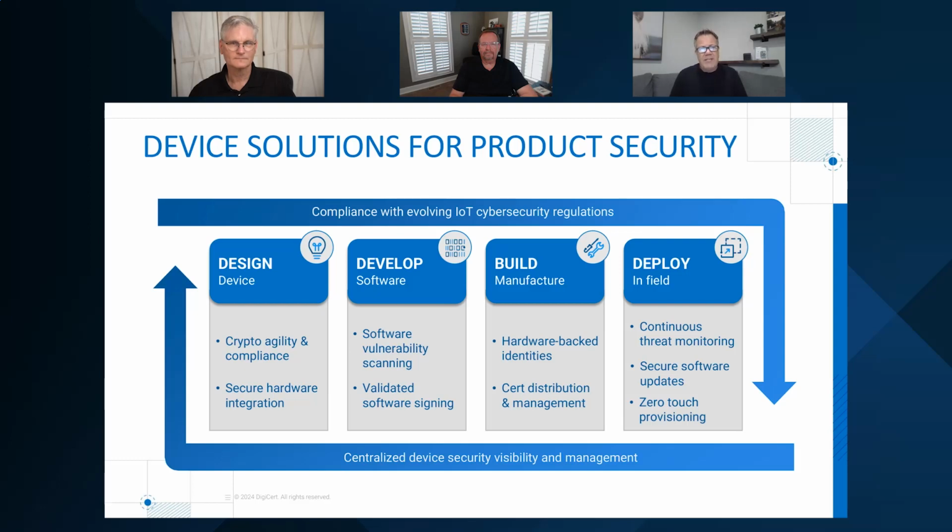Is the software on that device really tightly integrated to that particular device, right? And then when the software is developed, are we using software from trusted sources? Are we using third party libraries, open source libraries? Are we writing it ourselves? Is it being scanned by tools that developers would use to scan for vulnerabilities and secrets? And then if it's all scanned and good, are we signing it so that we only have validated software running on that device?